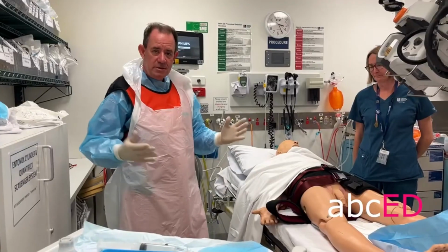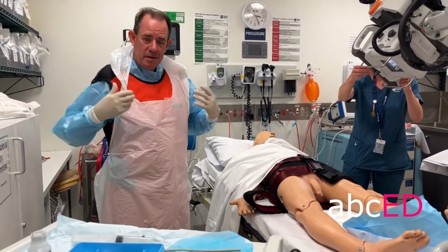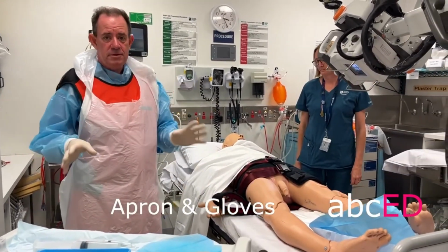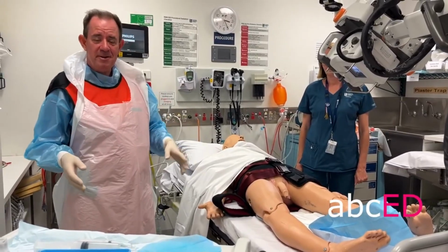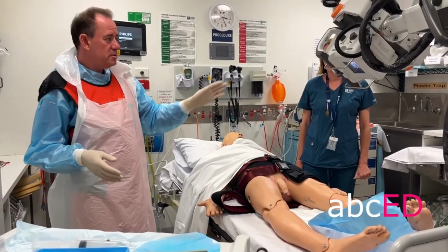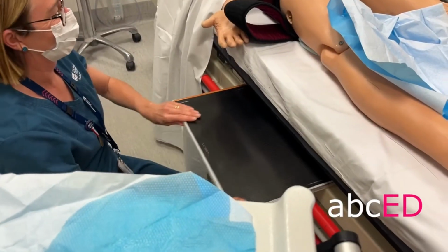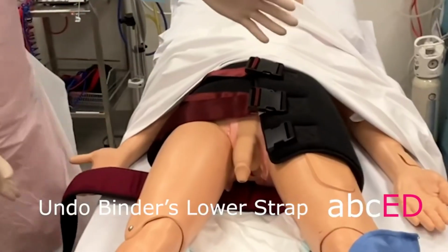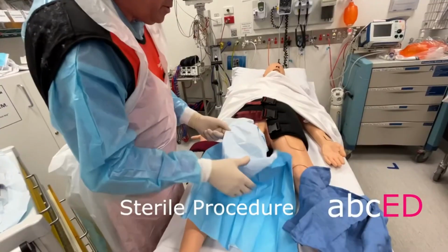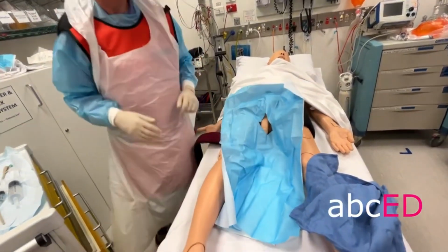And we do this in patients who are concerned for traumatic rupture of the urethra. Stand on the patient's right side wearing a lead gown, plastic apron, sterile gloves. Have your radiographer stand on the patient's left-hand side with the X-ray tube angled at 45 degrees towards the patient. Put the plate underneath. Have the lower strap of the pelvic binder undone. Use a sterile field as you would for any urinary catheterisation.